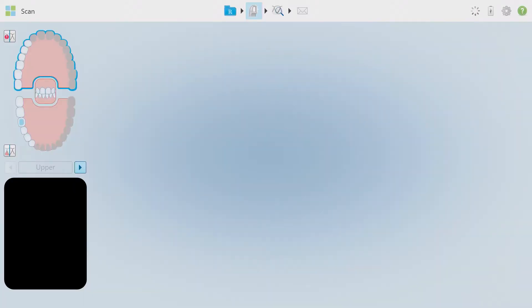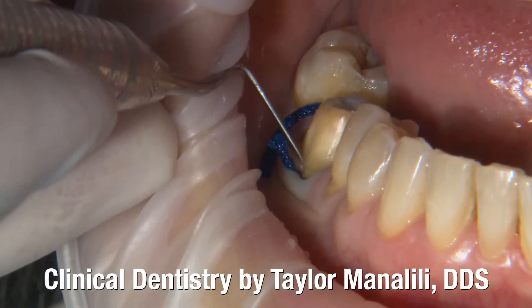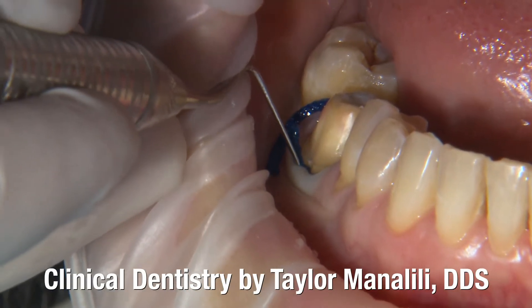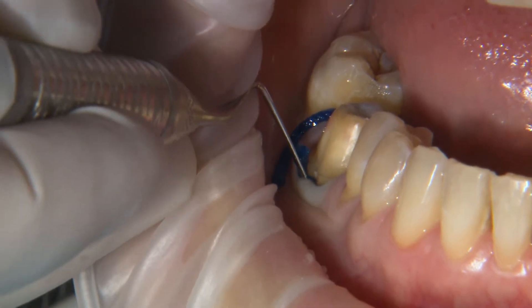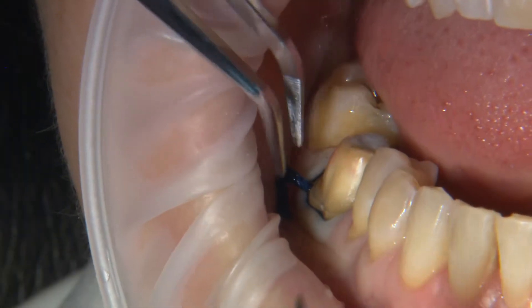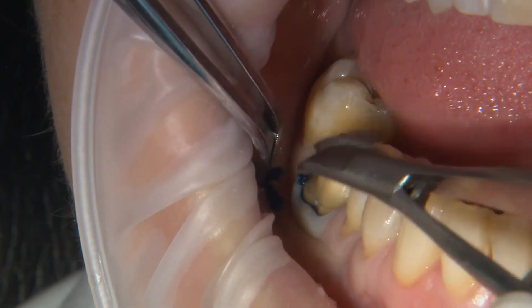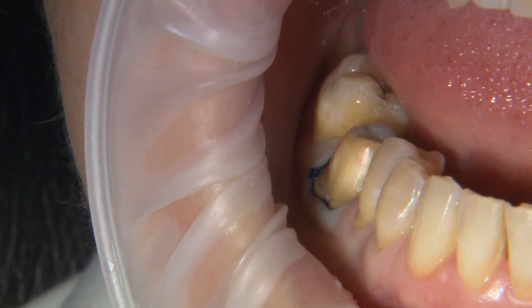From here I'm going to click on the scan button on top of the screen and I can leave the iTero in this ready position. Once my doctor's preparation is done, I want to quickly review two retraction techniques that our dentists at Gladwell Dental choose before scanning. Contrary to many rumors about digital dentistry, all other elements of the dental procedure must remain the same up to the point that the scan is taken. Tissue retraction is still a vital part of the process.